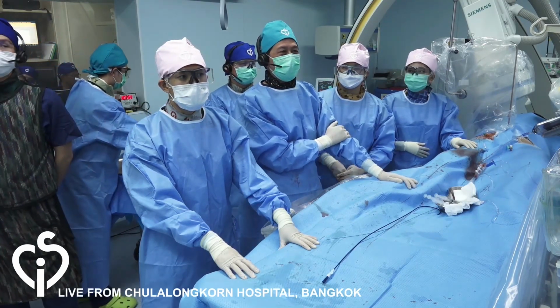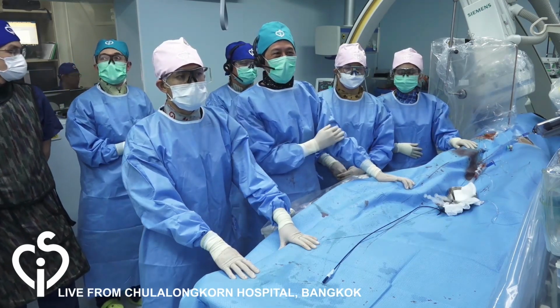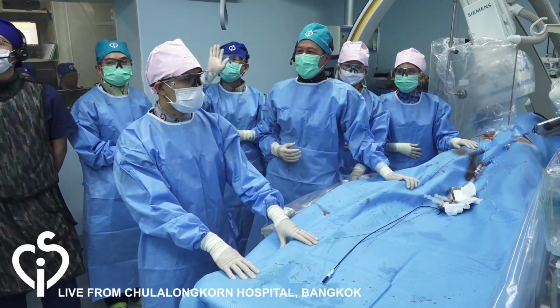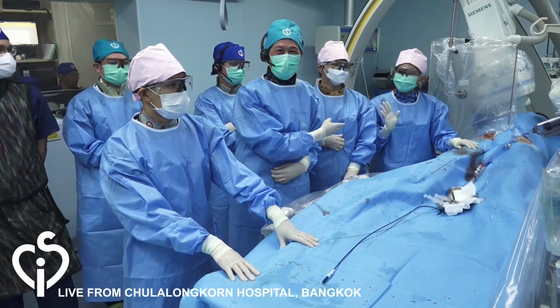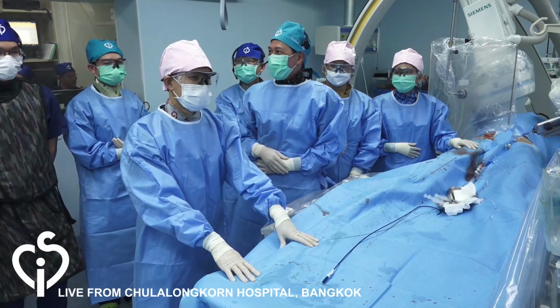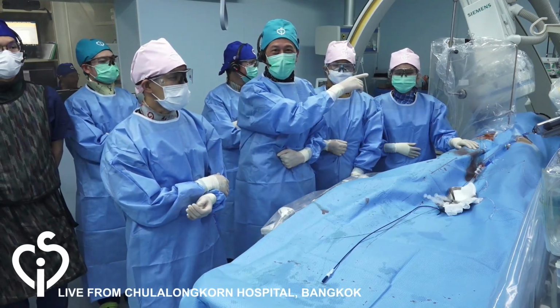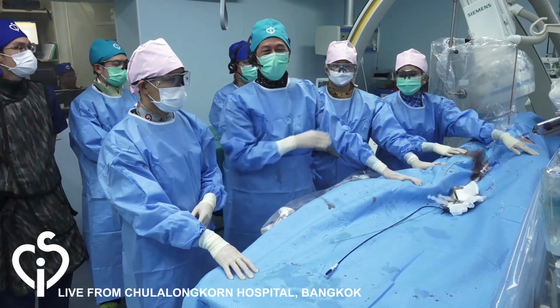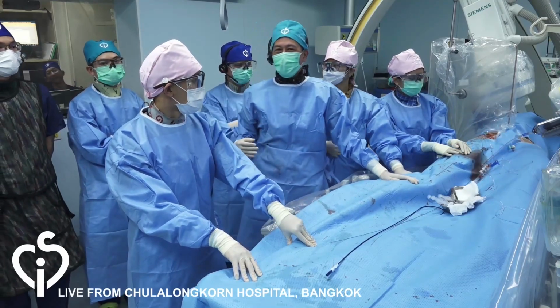Welcome back to our cath lab, King Chulalongkorn Memorial Hospital. I'm Dr. Support. With me are Dr. Ponte, Dr. Koi, and Dr. Ying, who is our operator and our fellow, Dr. Sup. We also have Dr. Sudarat behind the canteen. She's the echo guide for this session. And we also have our team.